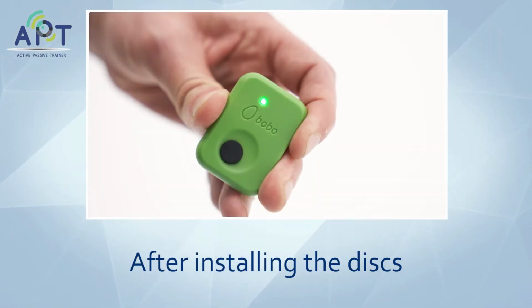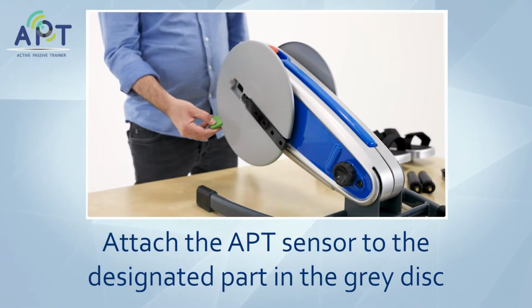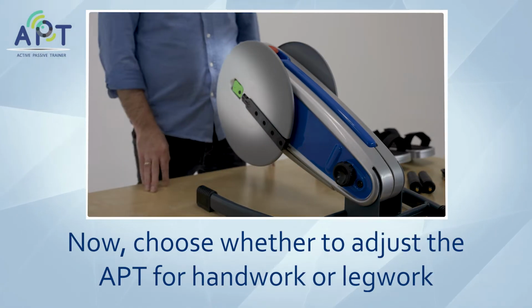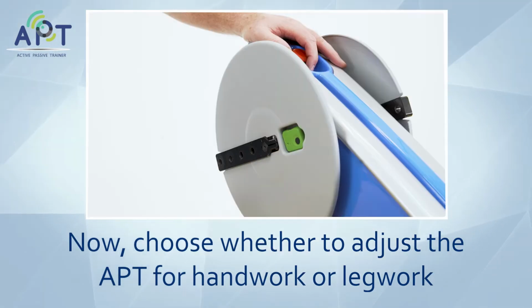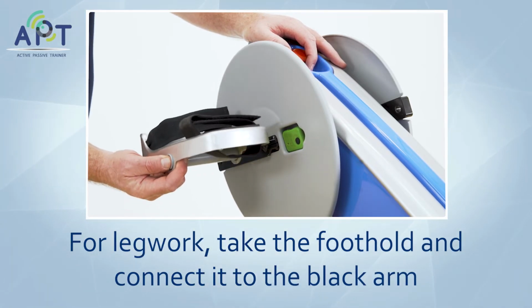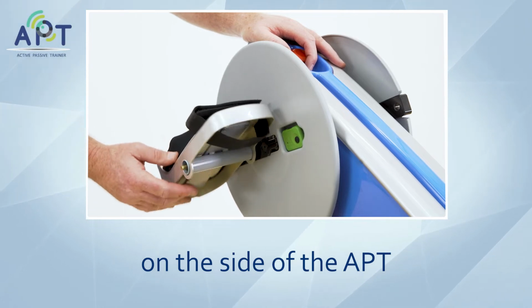After installing the discs, attach the A.P.T sensor to the designated part in the gray disc. Now, choose whether to adjust the A.P.T for handwork or legwork. For legwork, take the foothold and connect it to the black arm on the side of the A.P.T.